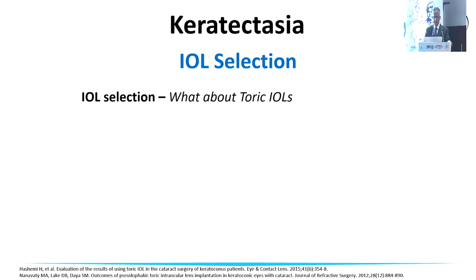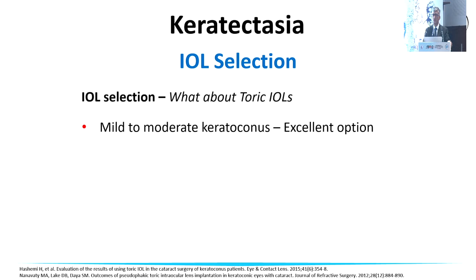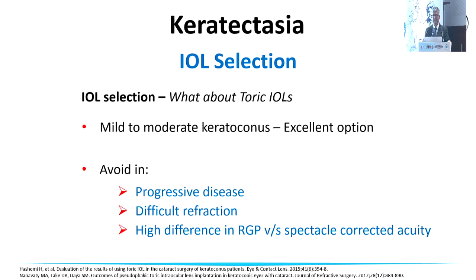What about toric intraocular lenses? For mild to moderate keratoconus, you get very good outcome from toric intraocular lenses.